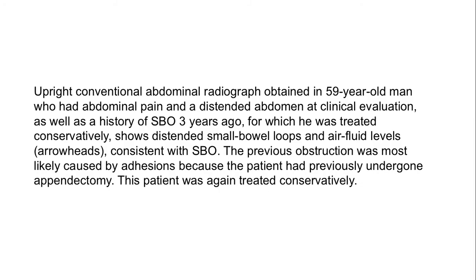When the technologist comes to do the radiograph, we will look at patients suffering abdominal pain. On clinical examination, there's the distended abdomen, okay? As well as history of SBO 3 years ago. So this is probably a recurrence. Alright, for which he was treated conservatively. So they followed the conservative treatment to eliminate this SBO.